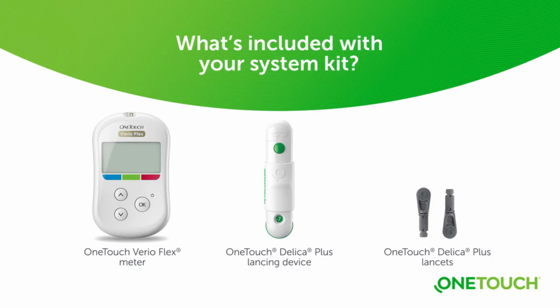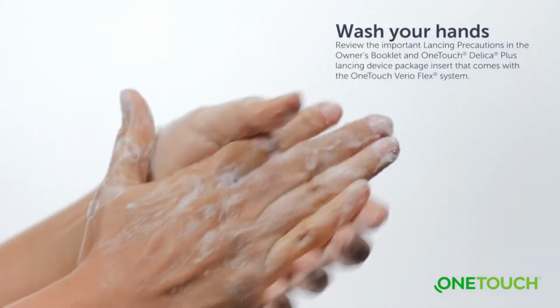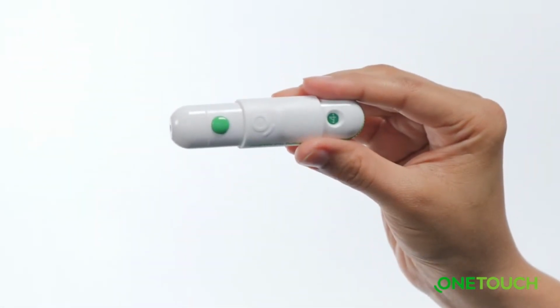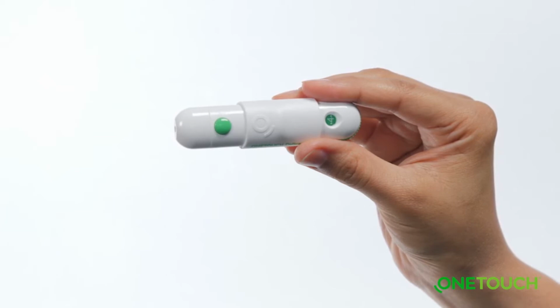Great! Let's continue. To reduce the chance of infection and disease spread by blood, make sure to wash the sample site with soap and warm water. Rinse and dry before sampling, and you're ready to lance. The lancing device is intended for a single user. Never share a lancet or lancing device with anyone, including family members and multiple people with diabetes.